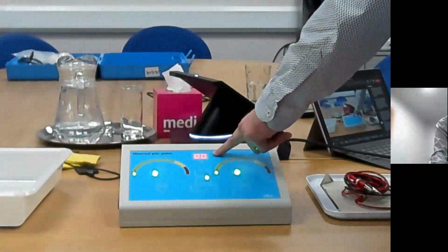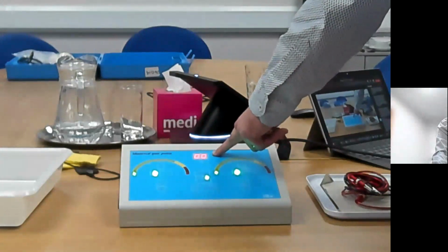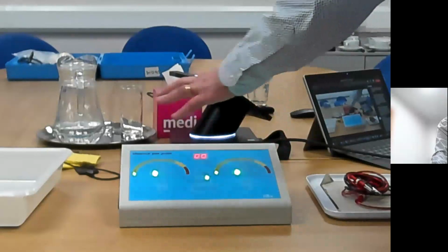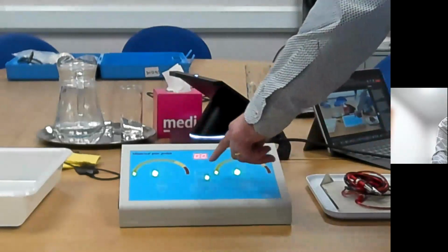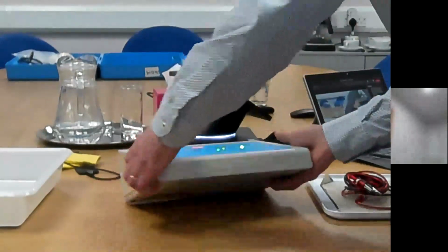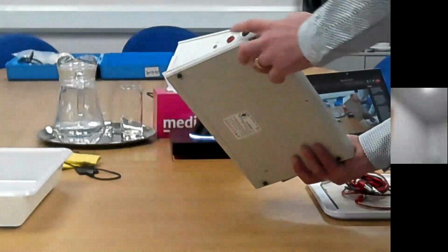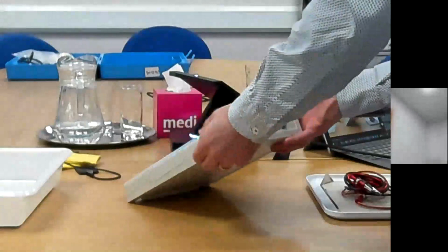It's useful though to have another stopwatch device or kitchen timer that you can time the treatment as you're going along, especially when you're treating the hands and feet, which I'll show you in a moment. There are two generators in this device. The left-hand generator is supplied through cables plugged in the left side, and vice versa on the right-hand side there.